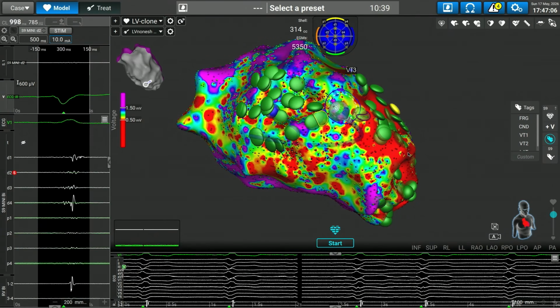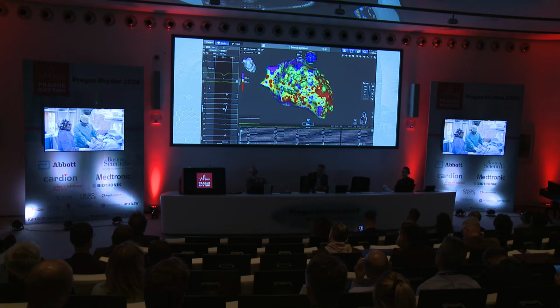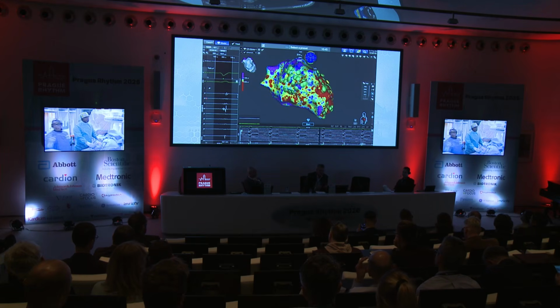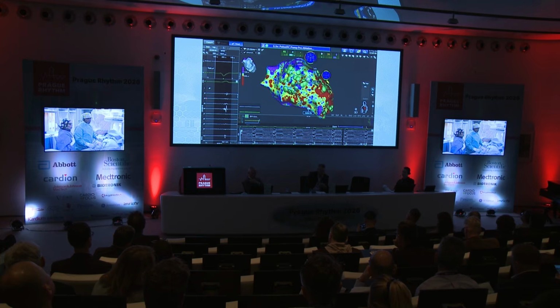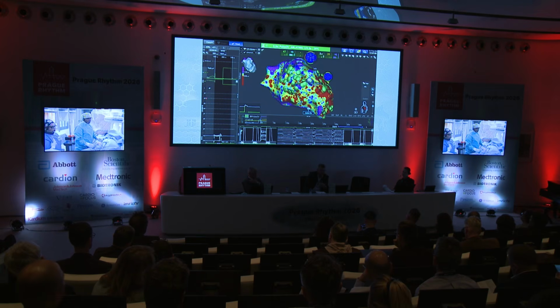Do you prefer to start with PF? Because what you have just said, that if you would like to start with RF, you may start PF on RF. And now if you want to continue with RF in some, let's say, difficult site, you can't do this because after PF, RF is, as you said, useless.